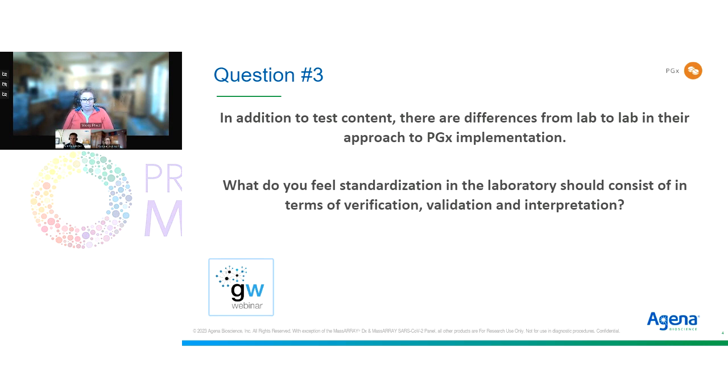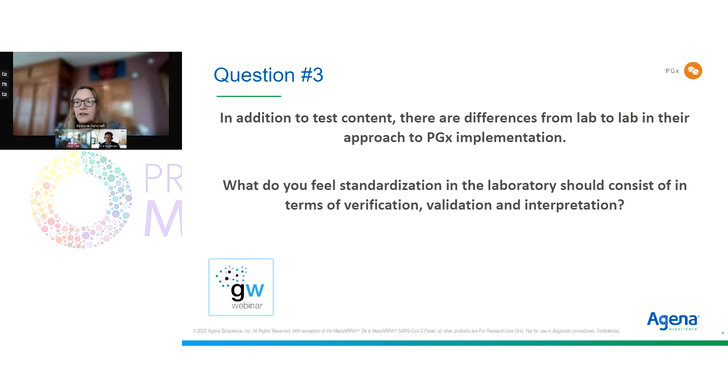Yeah. And I will say, in those labs that are in states that require a Medicare Z code and technical assessment, just validating with Coriell or GeT-RM samples was not enough. You did have to actually validate on a secondary methodology, so either trading samples with another lab or running it on a different platform than what you generally run your samples on in your own laboratory, if you're capable of that. It was a requirement as part of the validation they were looking for.